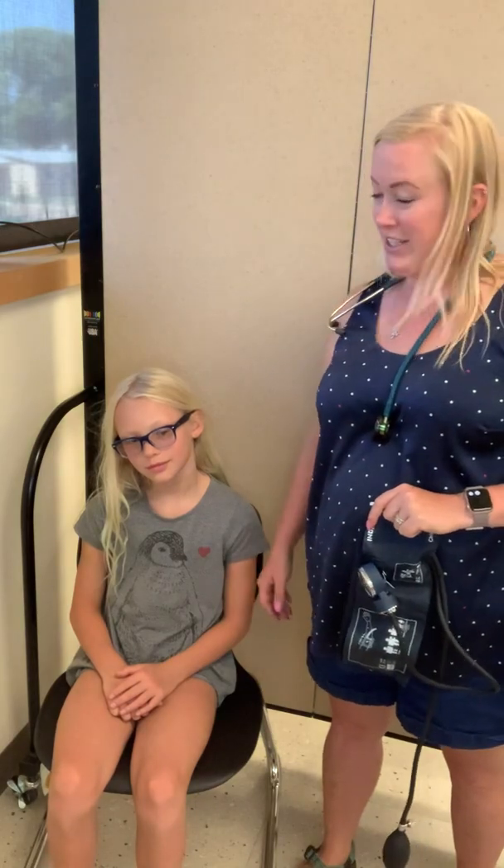Hello everyone, Nurse Oz here. I'm here to give you a quick demonstration on how to take a blood pressure on a pediatric patient. So we have my lovely assistant, my daughter Abigail, who is going to help us with this demonstration. She's volunteered to help us out here.